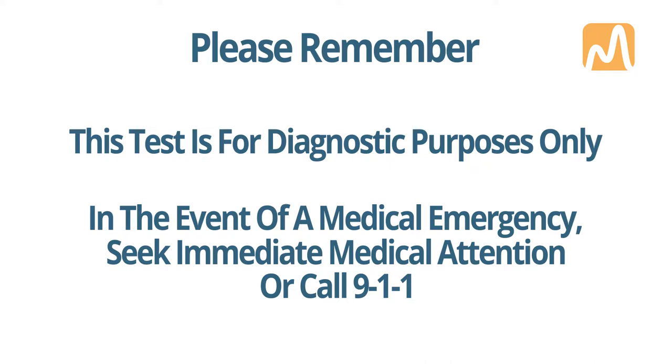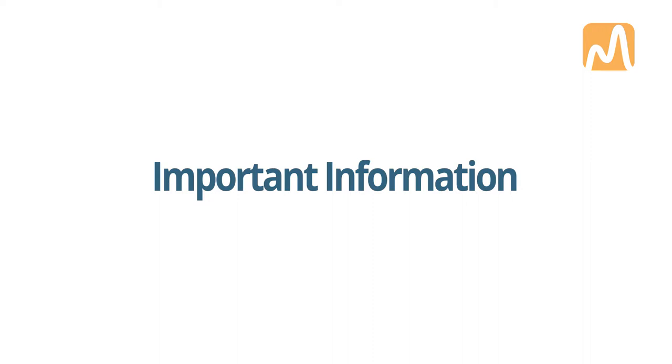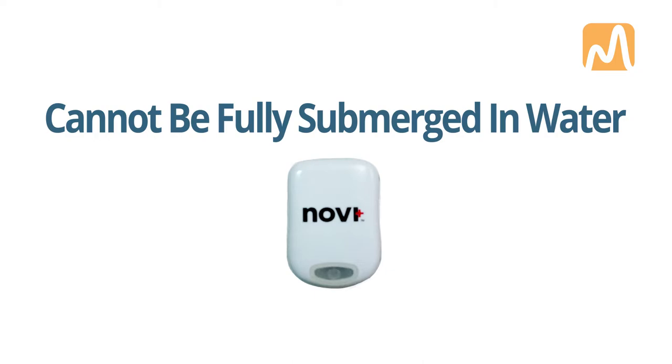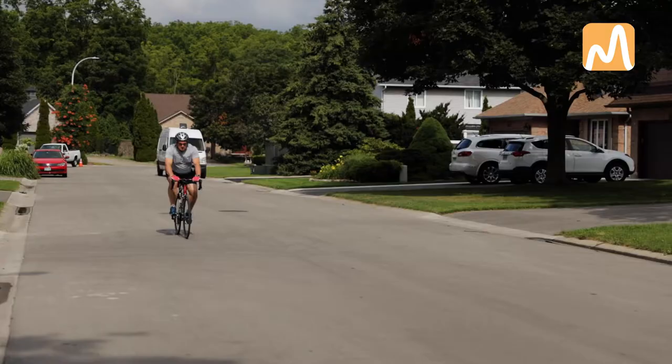Some important information about the test. Do's and don'ts. This device is water resistant and can be used with a light shower. Bathing and swimming are not permitted as the device cannot be fully submerged in water. Normal activity is encouraged while wearing the monitor.